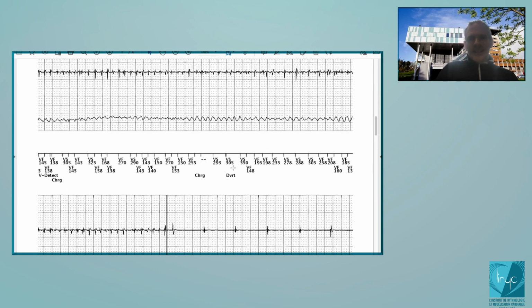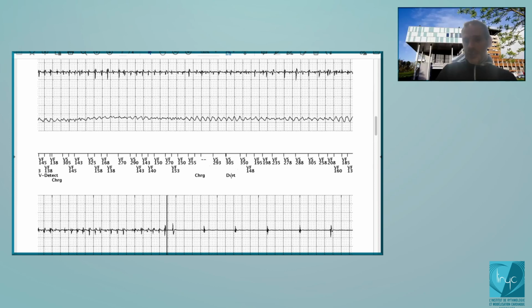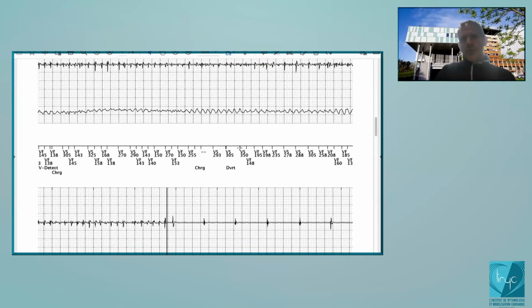So what you need to understand is that there are some weaknesses, fragility, according to the devices, and in Boston, this area is a particular area for the risk of false diversion of the charge because of undersensing. You understand? So at this time, no shock is delivered. So if you divert the charge, then you need to reconfirm with now 8 out of 10. You understand? Once more.